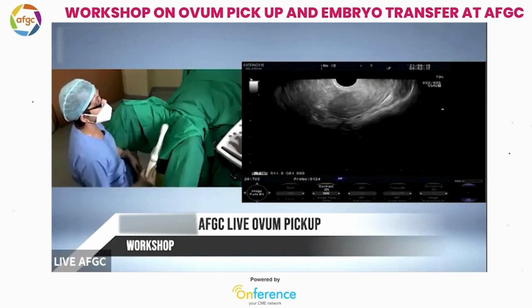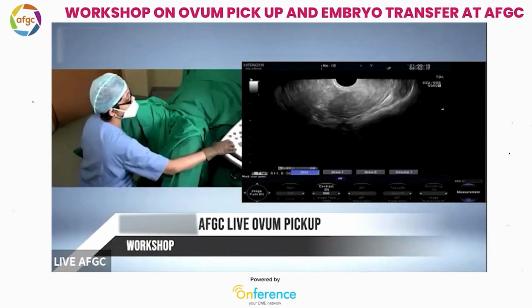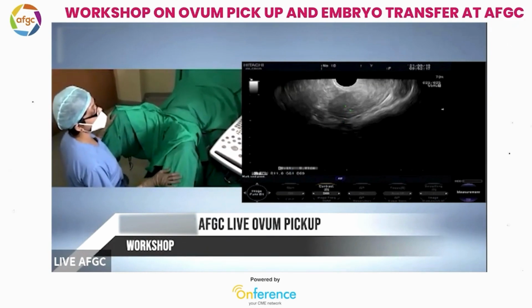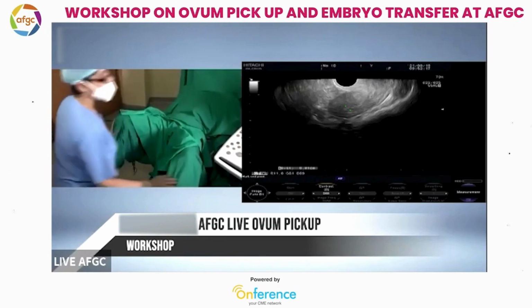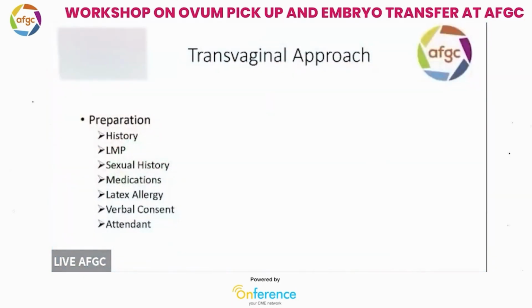Please measure. So while we go into the findings of the next case, we will discuss a few points on measuring antral follicle count. Antral follicle count is a very important measurement in transvaginal scan. It is said to be the total number of follicles measured between 2 to 10 mm just in the initial part of the cycle, post-menstrual.